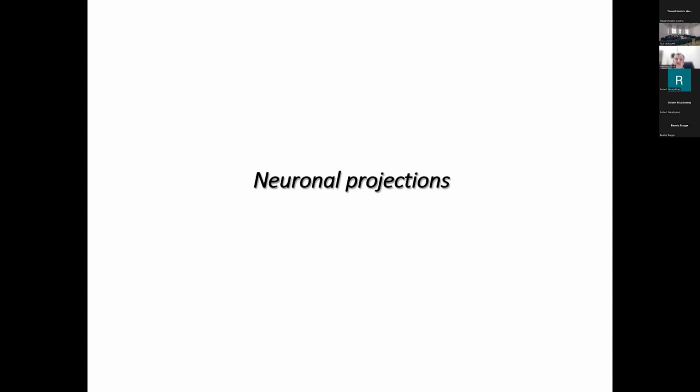So besides that, we are measuring the stages of microglial cells: are they activated or not? Are they undergoing fragmentation? And we can also measure neuronal projections directly, which is important in developmental biology and brain development, but also extremely important if we look at neurodegenerative diseases and neuroregeneration. And as we can see in the next slide.